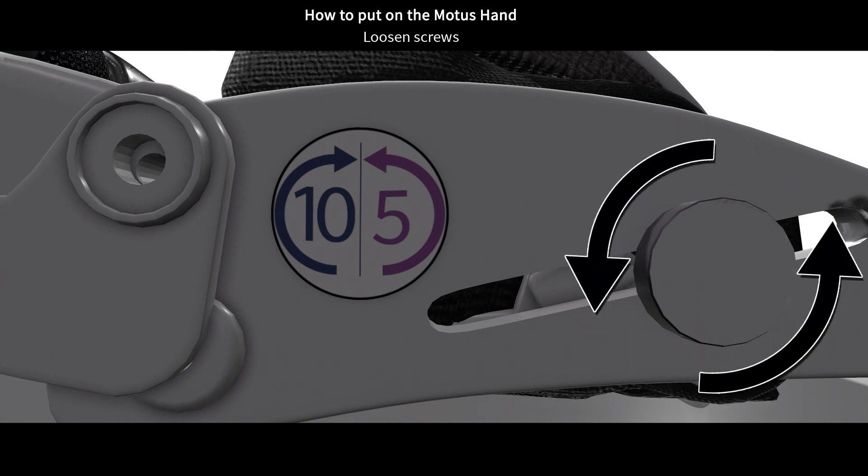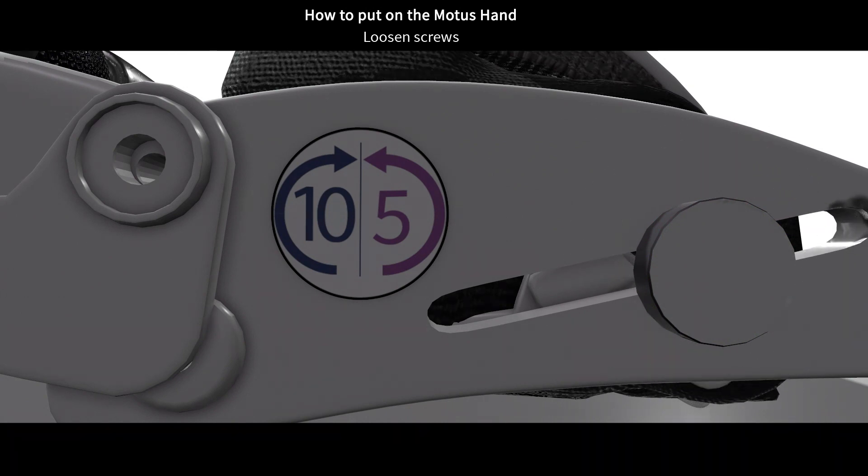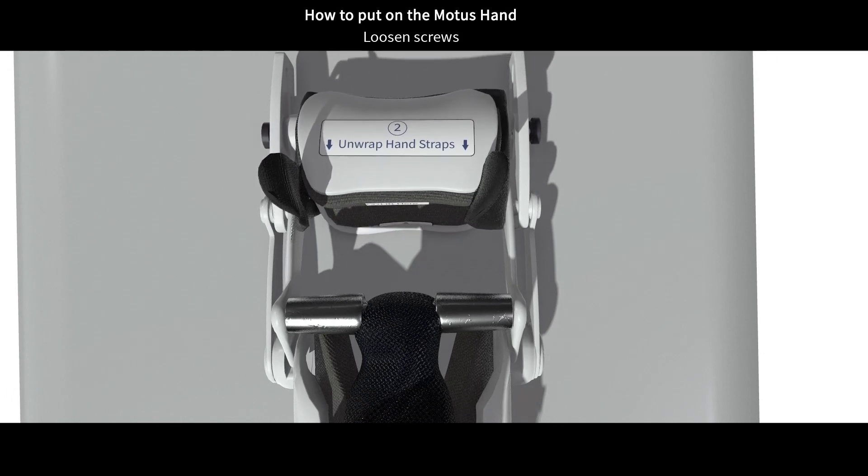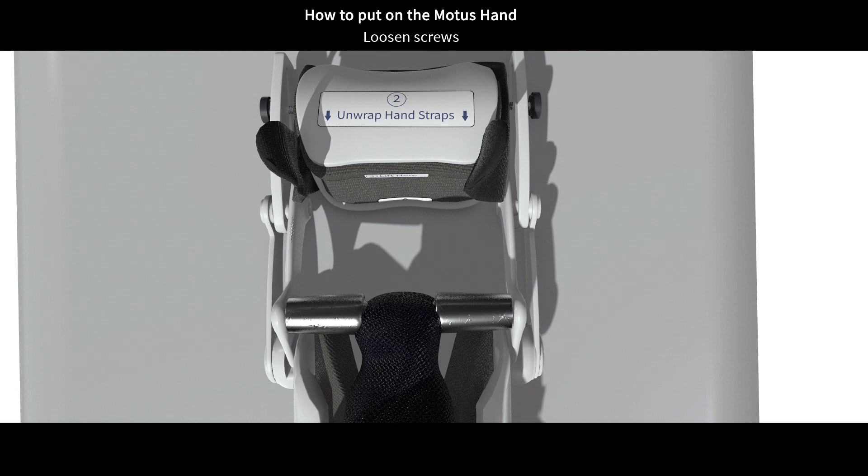When you are done with this step, you should be able to slide the hand pad back and forth, like this. Please press this button to continue if you have both screws loosened.